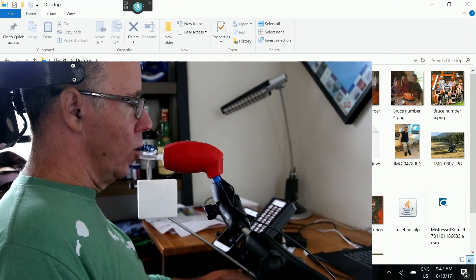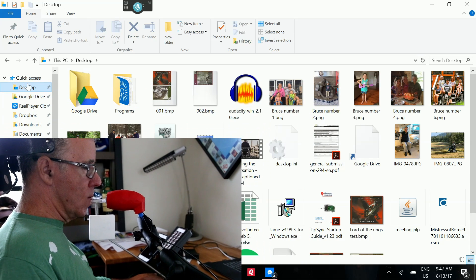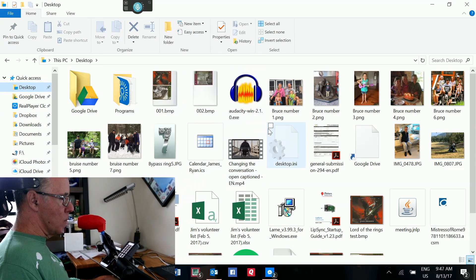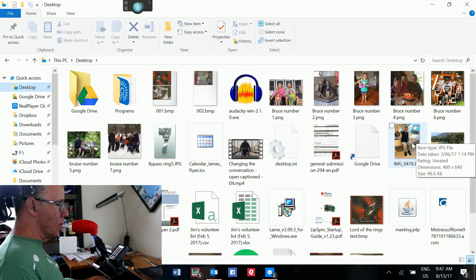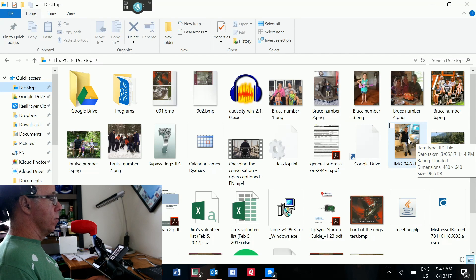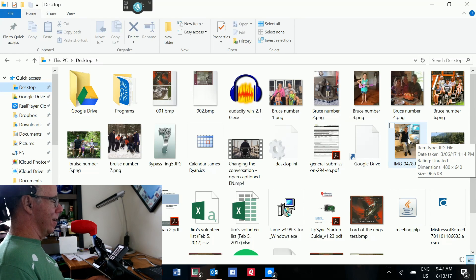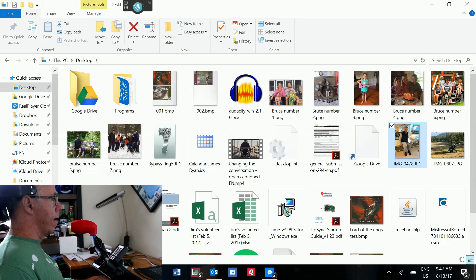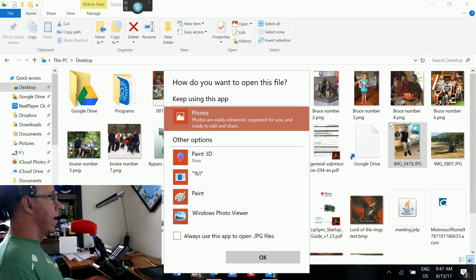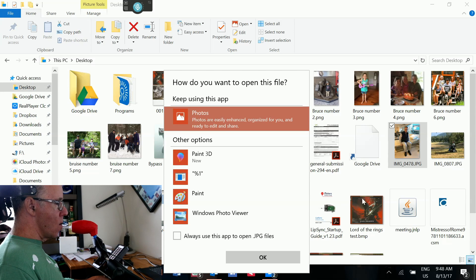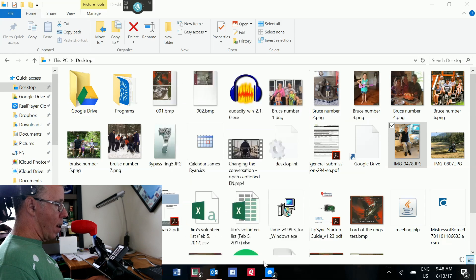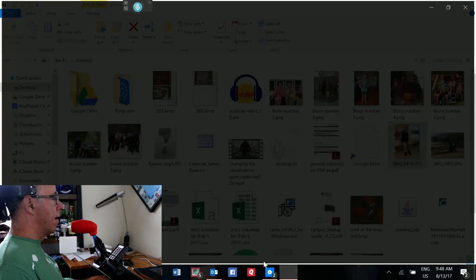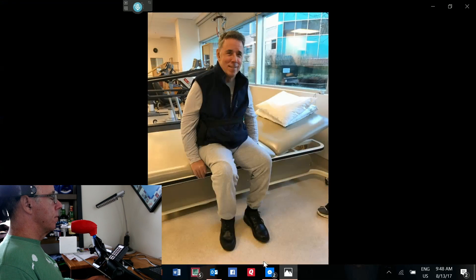Now, a double puff, and I'll do this, this is a picture of my cousins. All right, now here's a picture of me. So, as you know, to open a photo out of Explorer, you have to double click. So, I go like this. And then it asks me what to open with. I said photos is okay. And there you go.